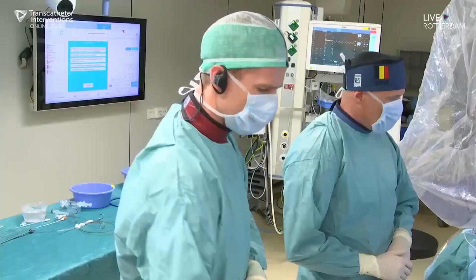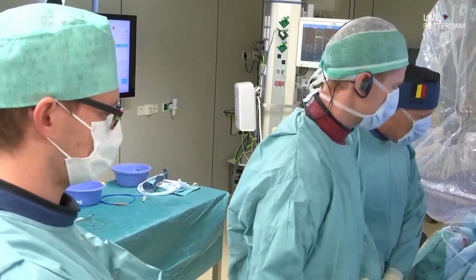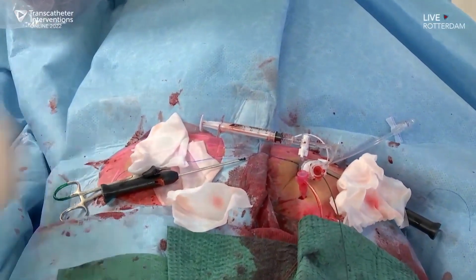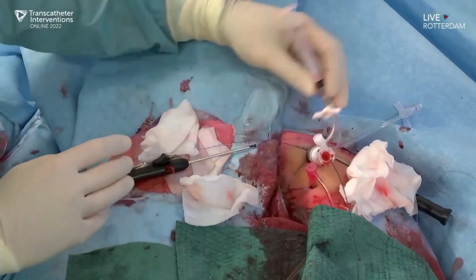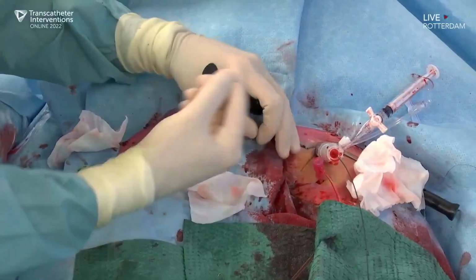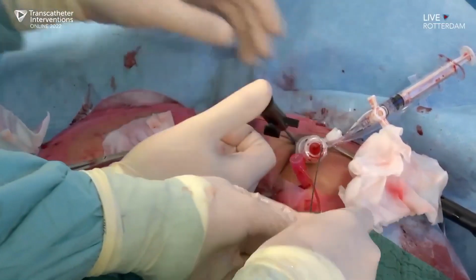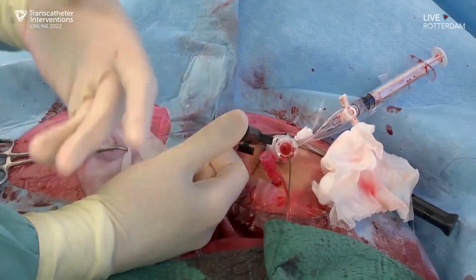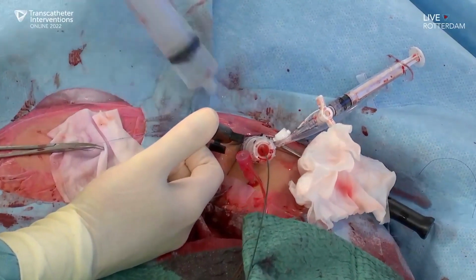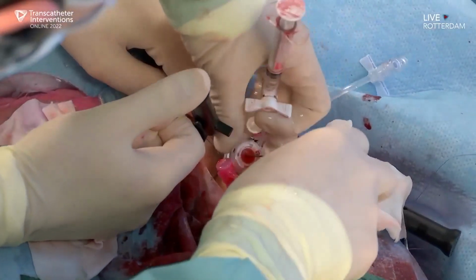So maybe we can show you then the closure, the access site closure. And again, we have this 4 French sheath in the superficial femoral artery on the same side. That is our safety. And we're going to give some protamine right now. And can I have some water? Let's make the sutures a little bit more wet. Then Rutger-Jan can withdraw the sheath.